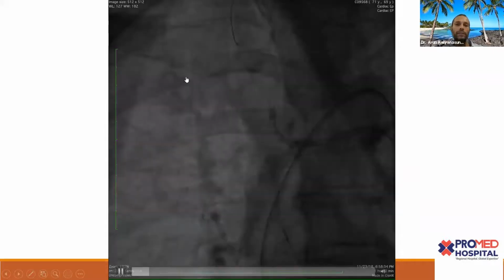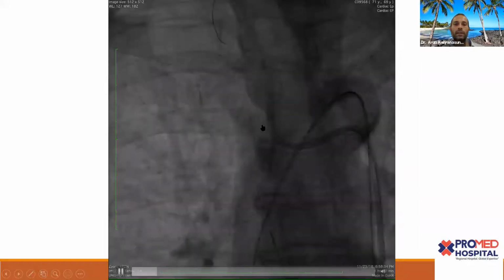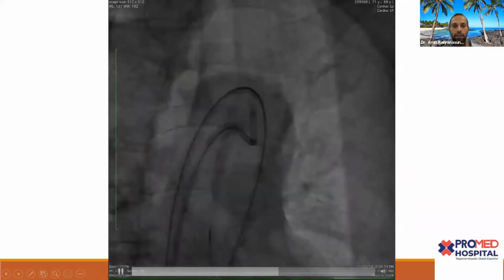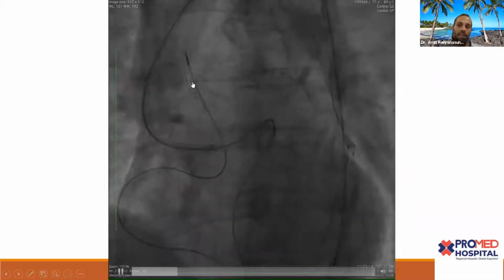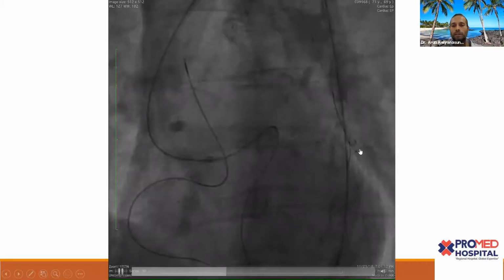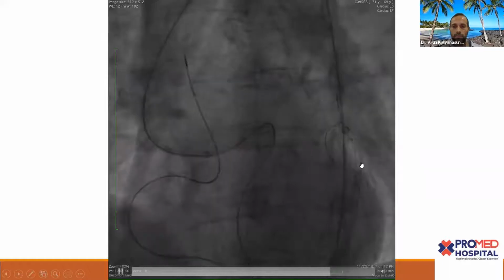And then they told me that there was no snare. So you need to learn how to make a snare. And so we just did a homemade snare. Essentially, it's a balloon and another wire that I just made into a snare, then cut it. And then once you've snared it, life gets a lot easier. In fact, I ended up snaring it here. You'll see it now. Boom, snare, boom, boom, boom, boom.